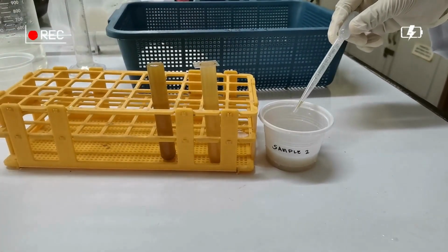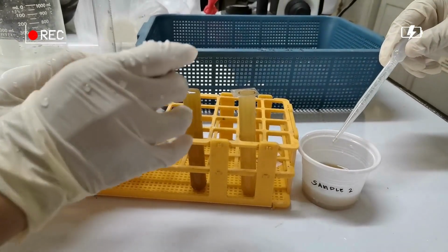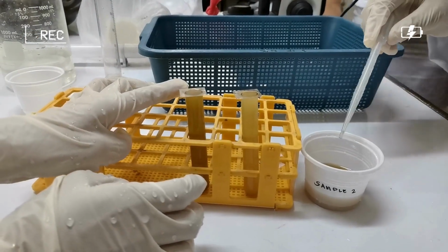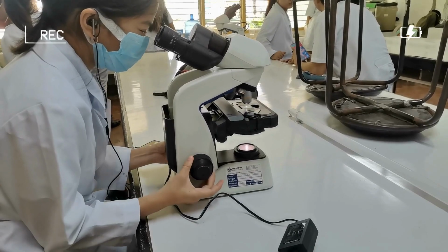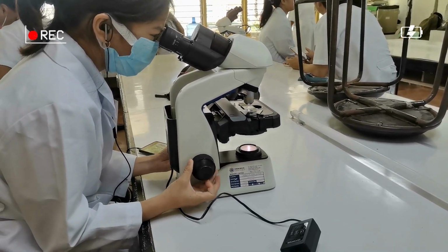The test tube was allowed to stand for 20 minutes. After 20 minutes, the cover slip was removed with a drop of fluid adhering to it. The cover slip was then placed onto a glass slide. The eggs were identified using a microscope.